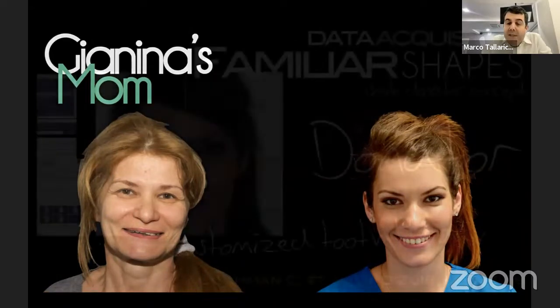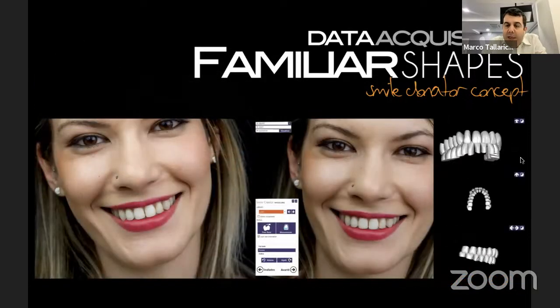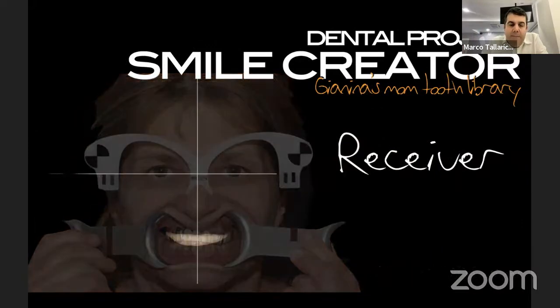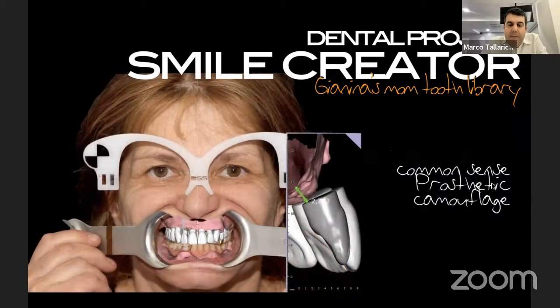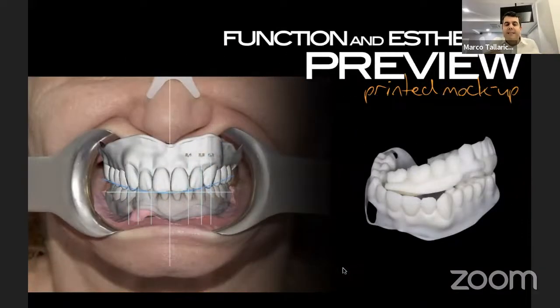But as I told you before, I have no reference point, but Janina, her daughter, works in my clinic. So Smile Donator, as I told you before, impression of Janina to create a customized library. So when I planned the virtual workup of her mother, I just opened the customized library from her daughter. This is the case, the smile, the new library after segmentation, planning longer teeth, guided surgery. I can plan everything, the length of the teeth, because I need to reestablish everything.